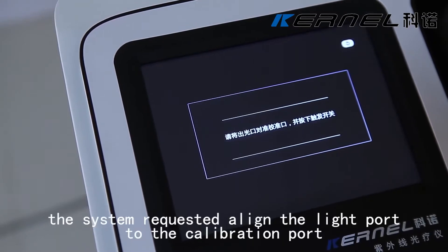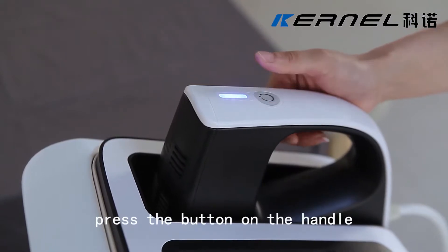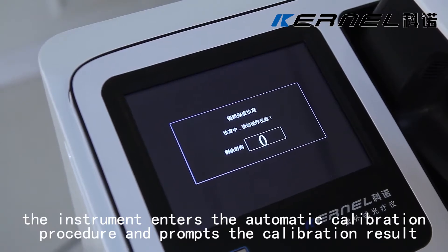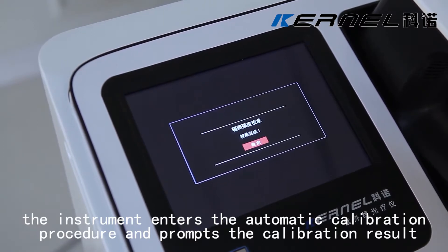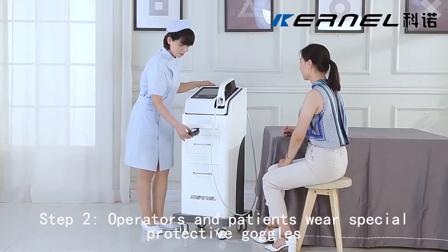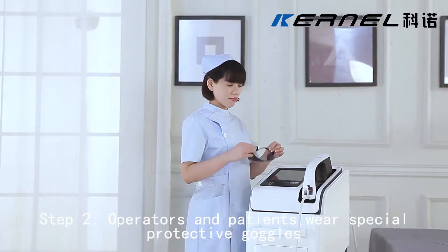KN5000D operation process. Step 1: Light source calibration. After a 15-second countdown, the system requests to align the light port to the calibration port. Press the button on the handle — the instrument enters the automatic calibration procedure and prompts the calibration result. Then click OK. Step 2: Operators and patients wear special protective goggles.